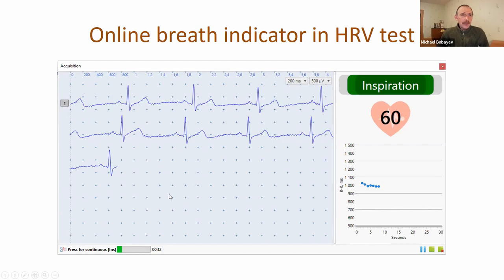We also added an online breath indicator for the deep breath test in heart rate variability. There is a special animation for the patient showing inspiration and expiration, and also a sound signal. So the patient can control breathing at the needed rate.